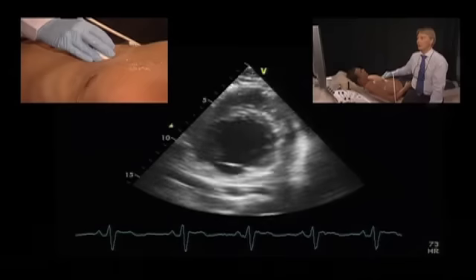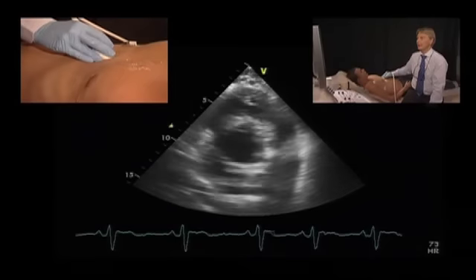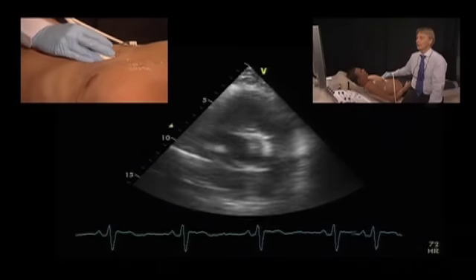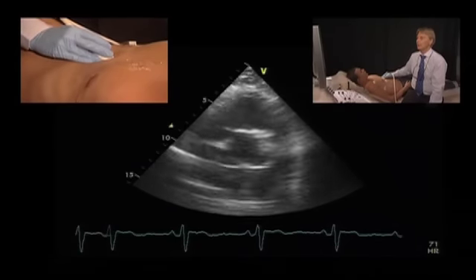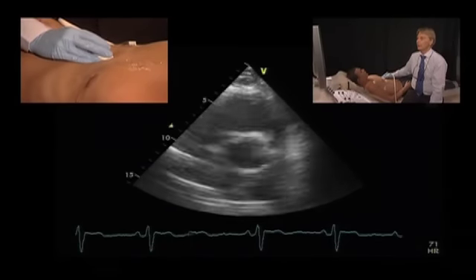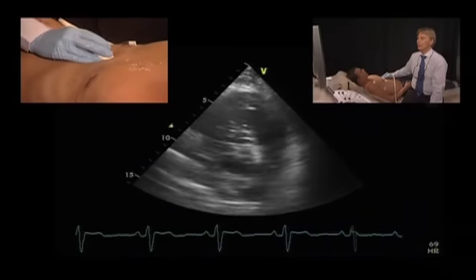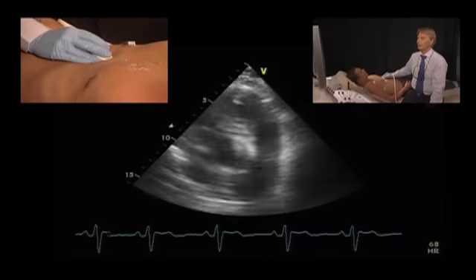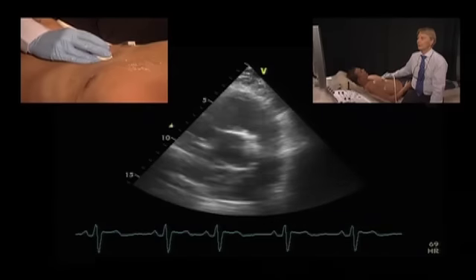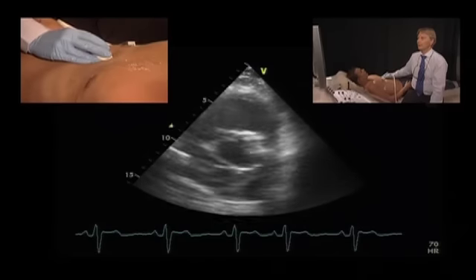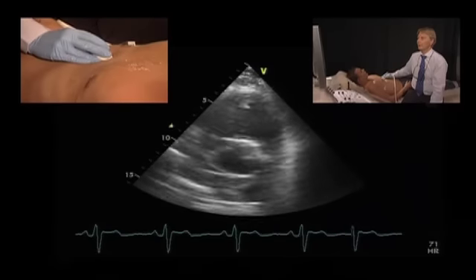And if you keep on going, you will then get to the base of the heart with the aortic valve in the center and the pulmonary artery with the bifurcation.